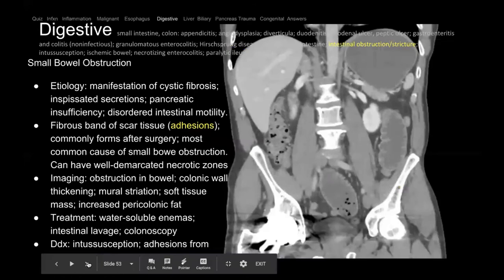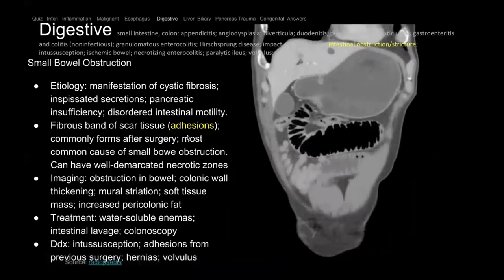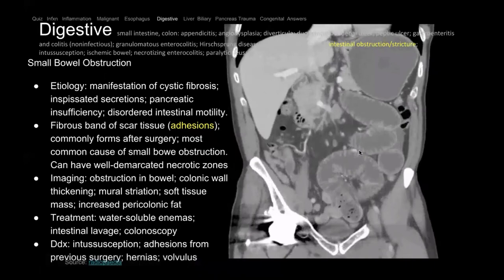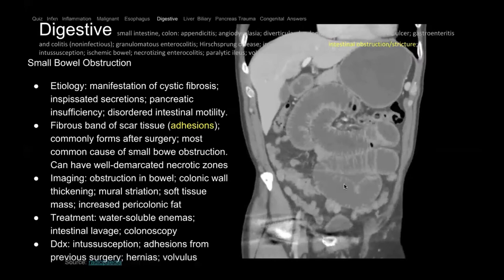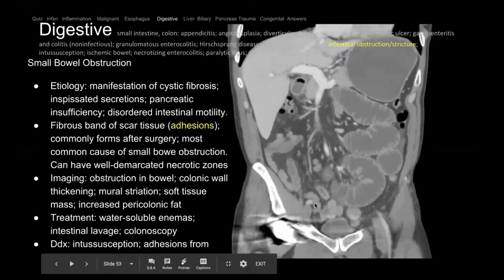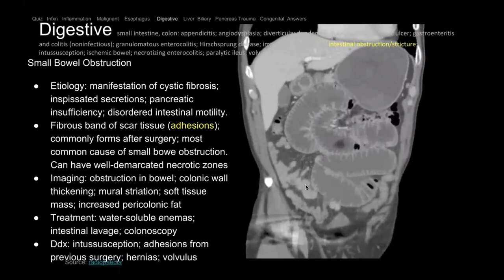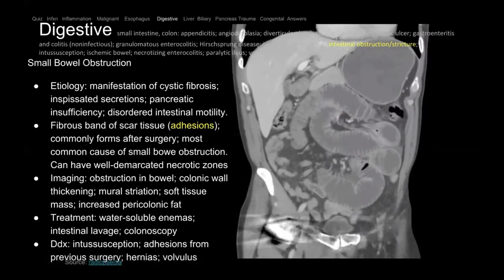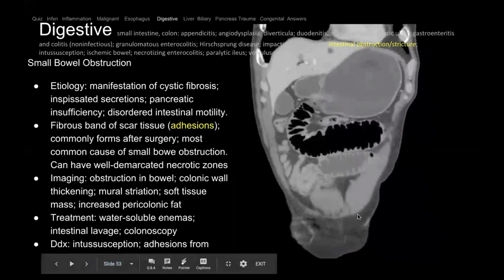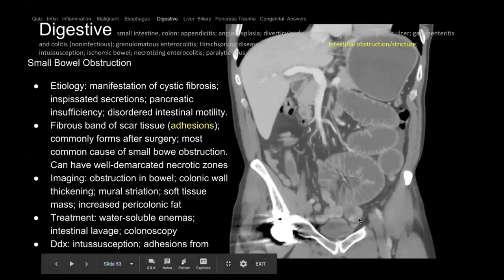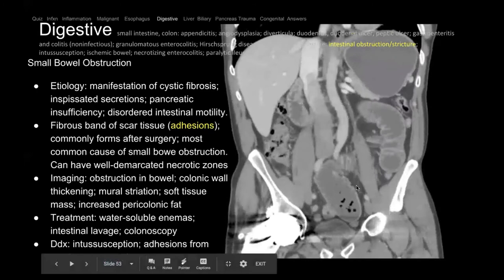Now we're talking about adhesions and small bowel obstruction. Patients who have surgery can get scarring bands called adhesions that can cause obstruction any time after prior surgery. Here we see small bowel that's very dilated and the distal bowel is decompressed — like a kinked water hose, upstream gets big and downstream gets small. The arrow points to where the kink is. Adhesions are the most common cause of obstruction, but other causes include hernias and cancers.